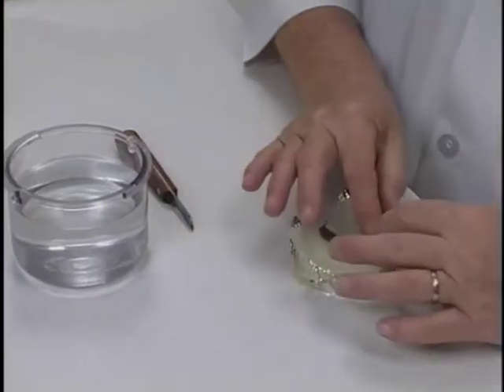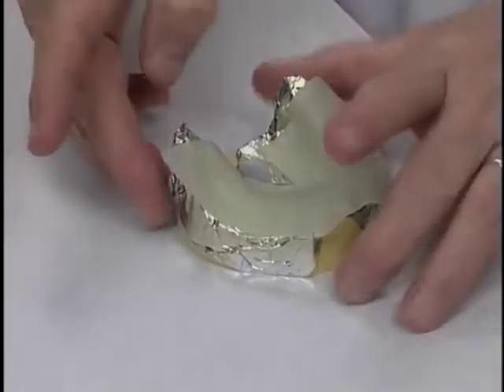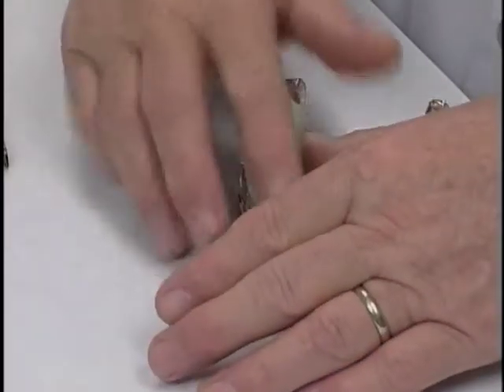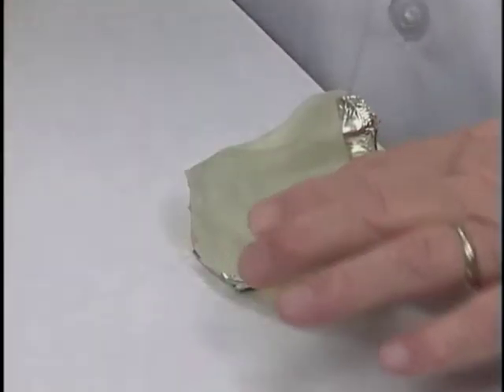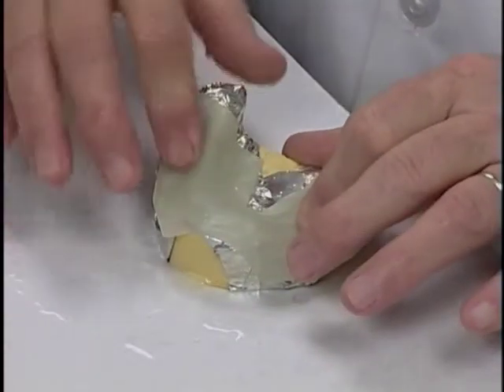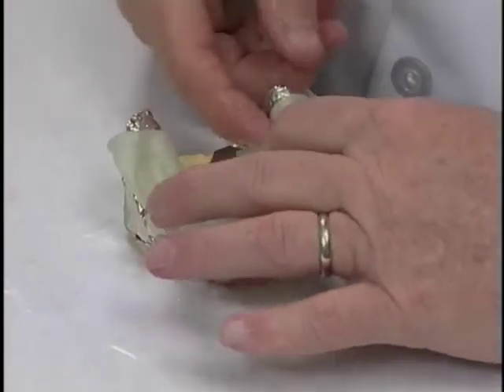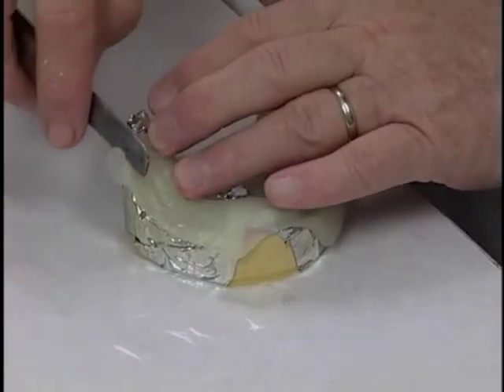And if we end up with some void, it'll be back in the posterior region, but we can use the excess material to adapt that. So we adapt the material onto the cast, just as we did on the maxillary. And now we can cut the excess off.